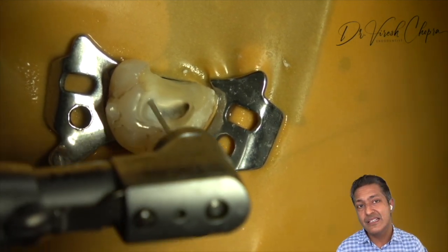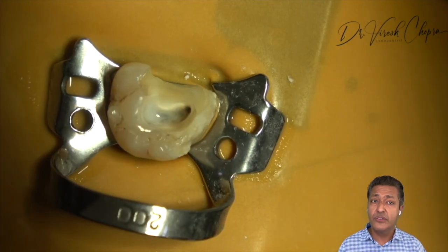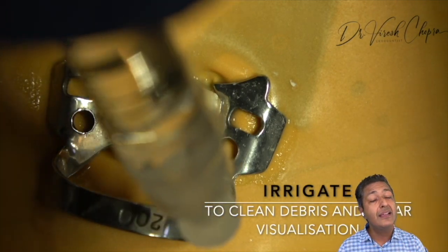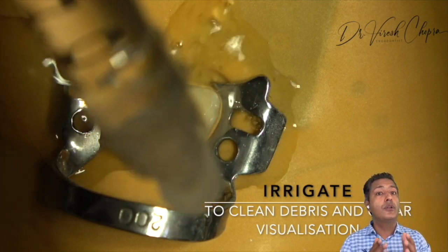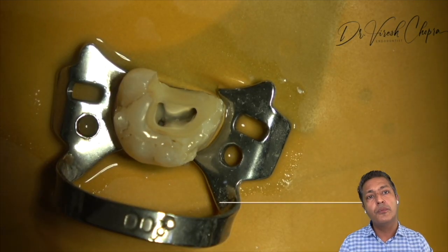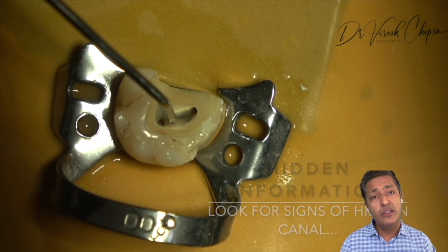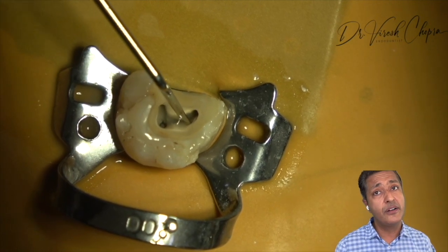So once this is done and all orifices are enlarged, we need to use irrigation for clear visibility, and this is the time when we have to introduce a 10K file again gently and see till what point it goes, or in other words it has to go to the point of resistance, but do not force. Once it goes to the point of resistance, take it out and measure on the file. This is the correct point where, if we have all the three canals, we can negotiate with a 10K file and confirm with an Endodontic Explorer.